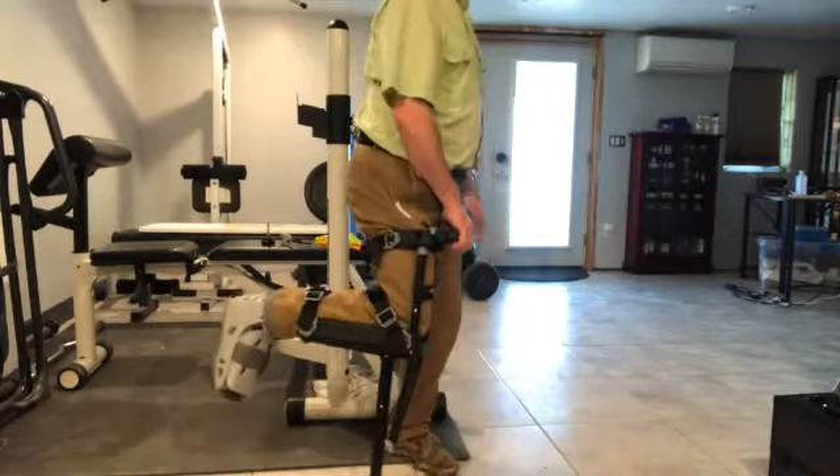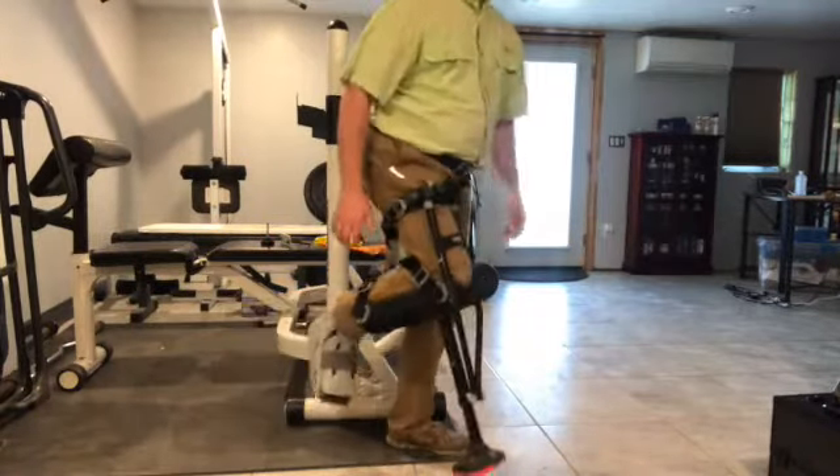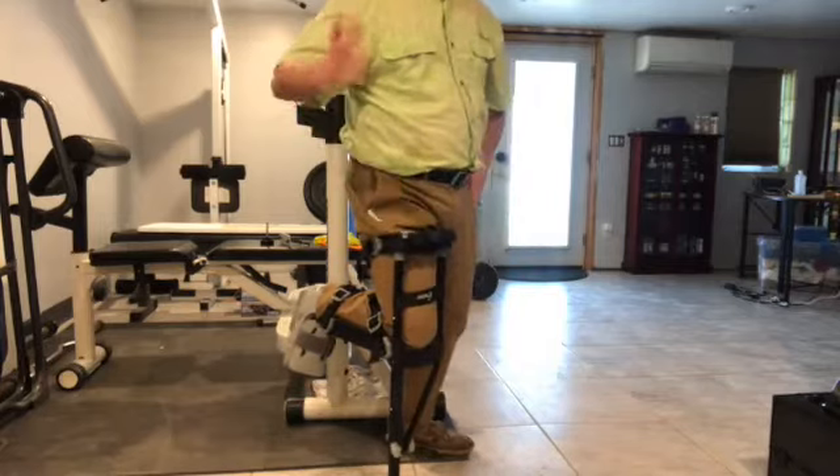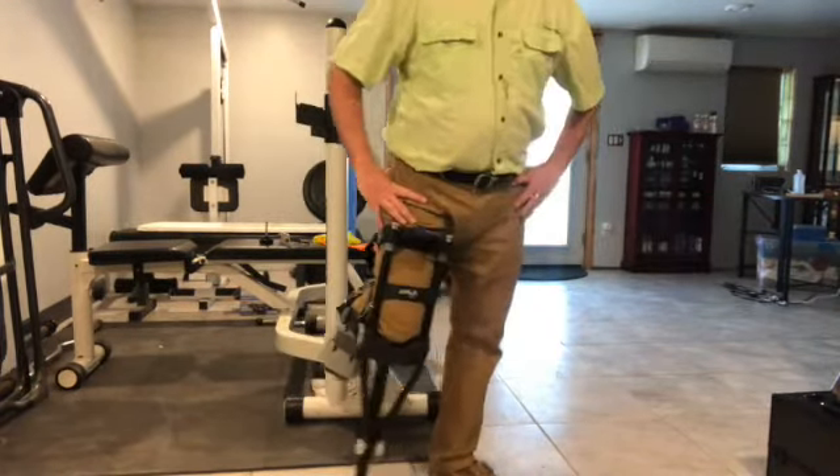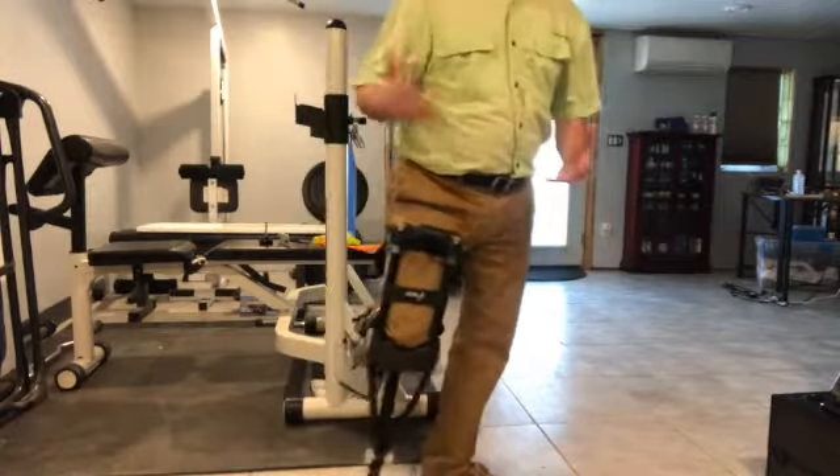For those of you who are contemplating the iWalk, I think this is probably the best thing you could ever get. I could use a saw, go up a ladder, up and down steps — there's virtually almost nowhere, nothing I cannot do with this thing.